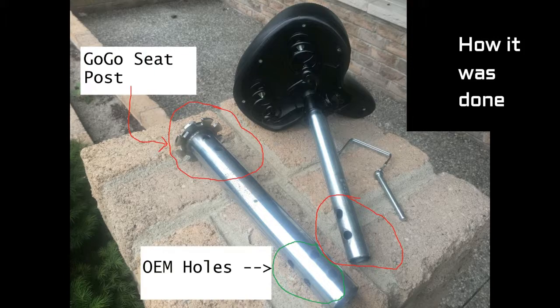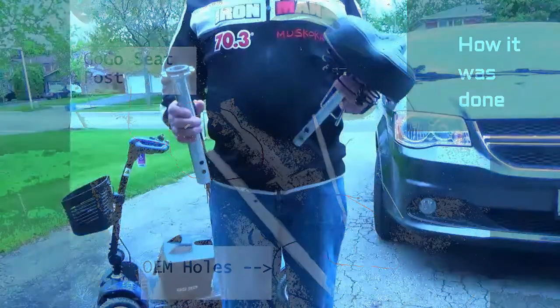On the left is the GoGo seat post that's been pulled out of the unit. Here on the bottom of the seat post, circled in green, are the original equipment manufacturer holes drilled so that it can be fastened to the base of the unit. I took this to my local shop and my friend Brian drilled new holes in the top of the GoGo seat post — circled here in red, there are two holes drilled there. I also had them put two more holes in the seat post in case we wanted a different height adjustment. You really need a drill press to drill these holes to make sure they line up so the pin can go through.